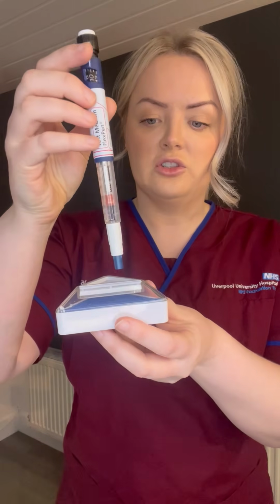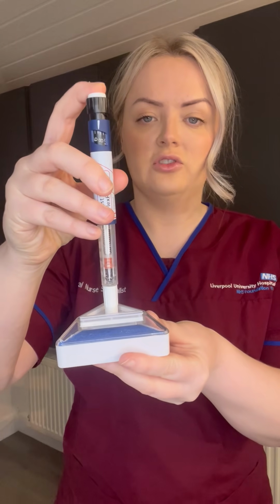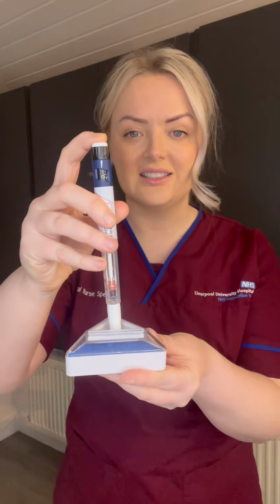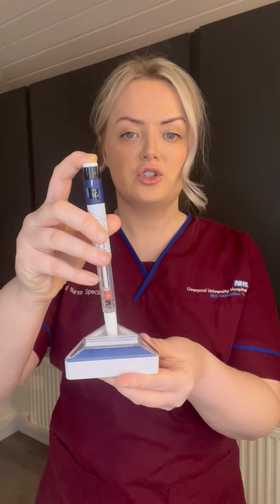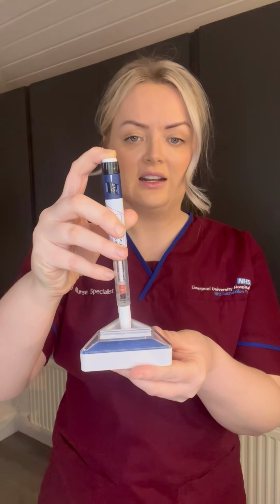You don't need to clean it before. The patient should be suitably clean, and what you want to do is be feeling for the area first to make sure there is no lumps and bumps, deciding that that's the area you want to inject into. And then what you want to do is go in at a 90-degree angle as shown and just go directly into the skin and make sure it punctures, and then all you do is gently press down on the insulin pen until it goes back down to 0. Once it's back down at 0, you count to 10. So 1, 2, 3, 4, 5, 6, 7, 8, 9, 10.